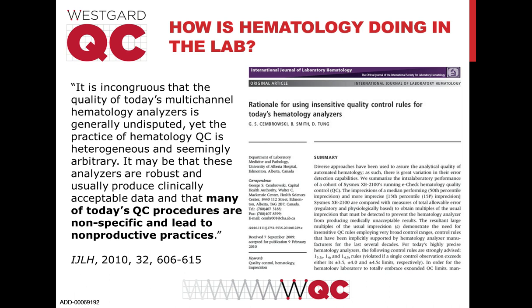So in some recent surveys, we've seen a 12-fold variation in QC. Some recent surveys have shown that here in the U.S., in some of the leading academic medical centers, some labs are doing QC once a day, and other labs are doing QC 12 times a day. A 12-fold difference. That's telling us that the practice of QC is not very standardized, even in some of the best institutions in America. And that means we really need to bring better tools and assessments into how we practice our QC.